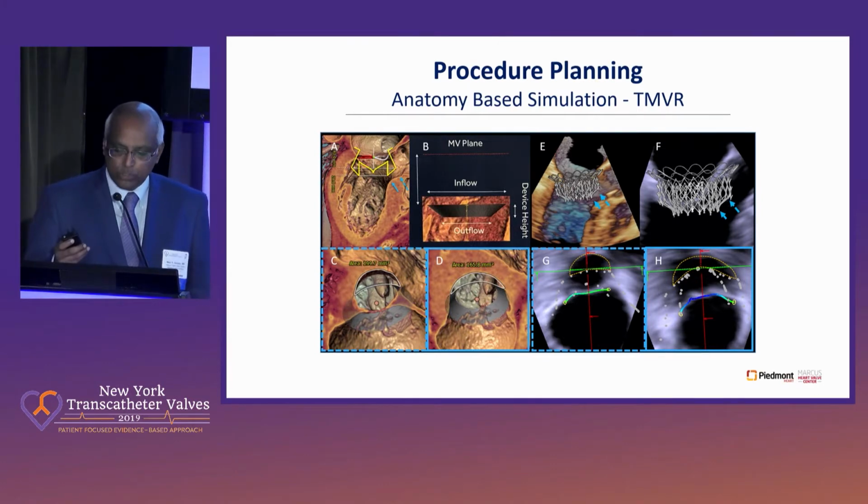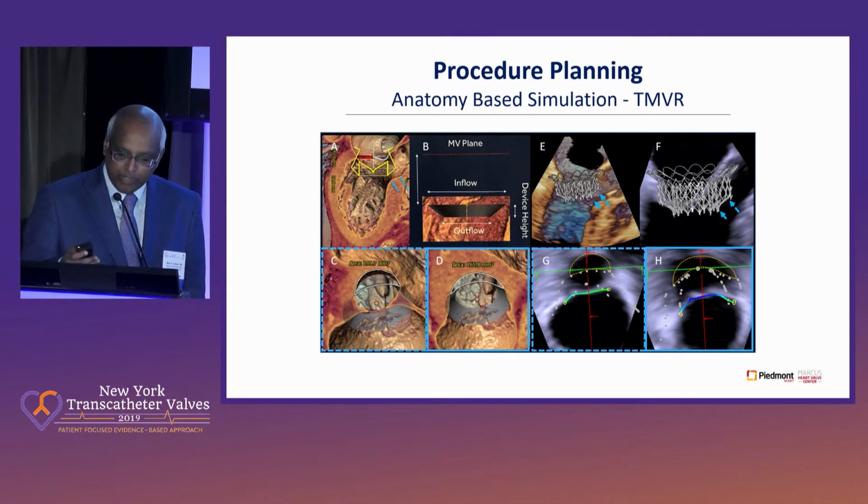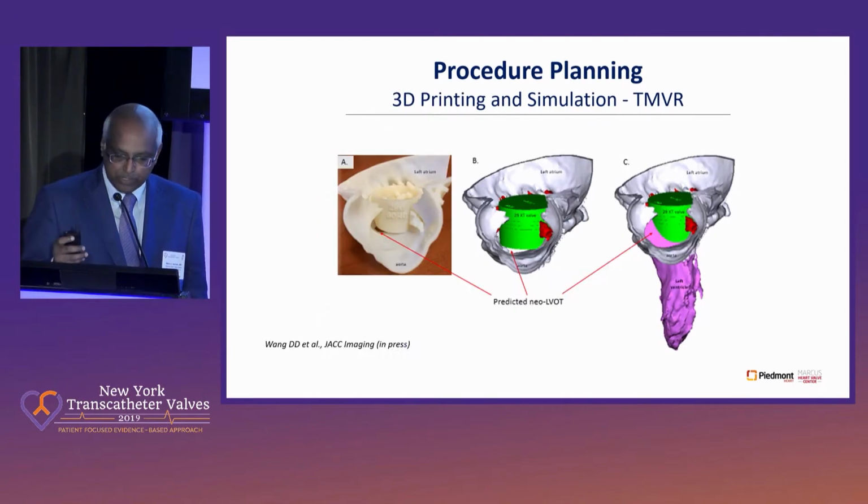measure the so-called neo-LVOT. This is an area I think that is maturing, and I think we know a little bit more, but not there yet. We still have to understand the interaction between the valve and the tissue, and not just put it on computational models such as this. But this is an exciting area, especially in the mitral position.